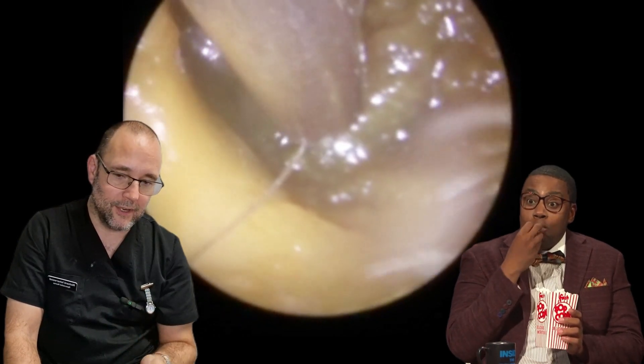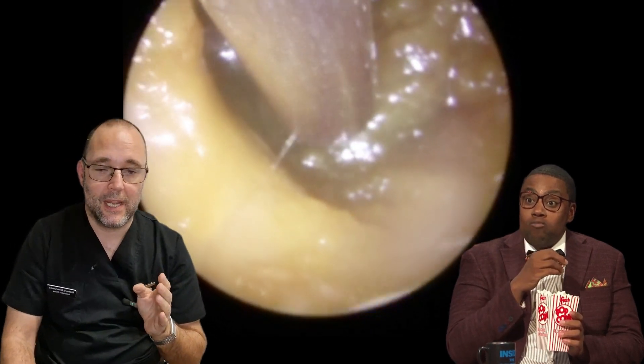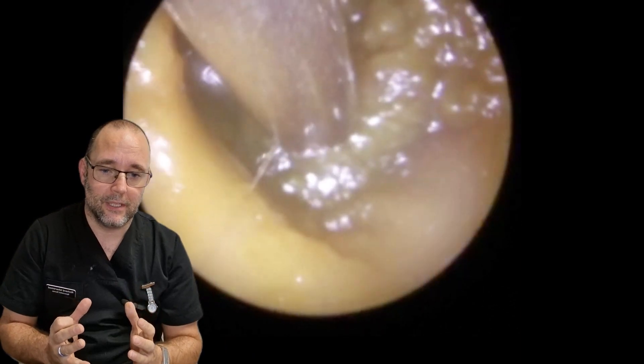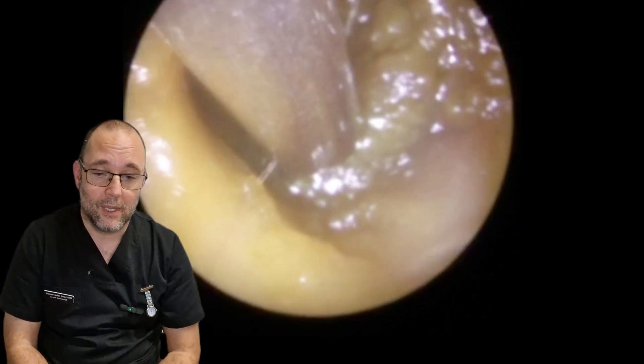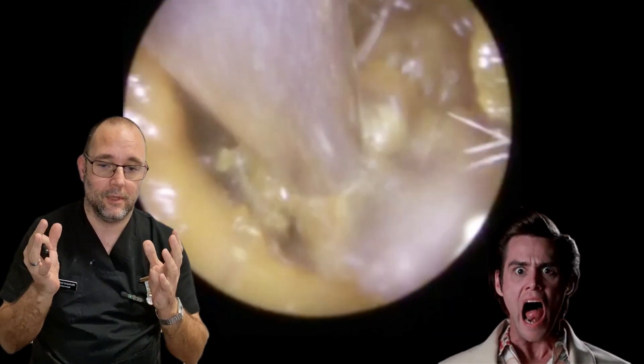Exploring that area to see if I can just lift that up slowly, and as I suspected — in a minute you'll see the whole thing jump up into the tube. It's very satisfying when it goes that well, and it was relatively quick — on it instantly.